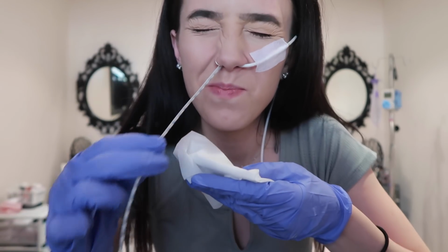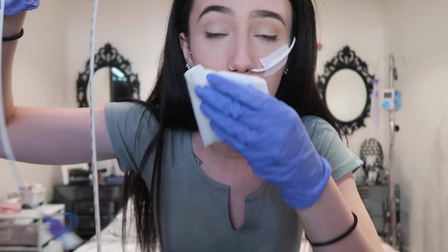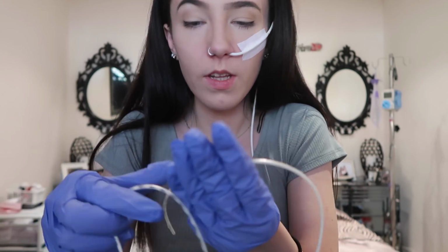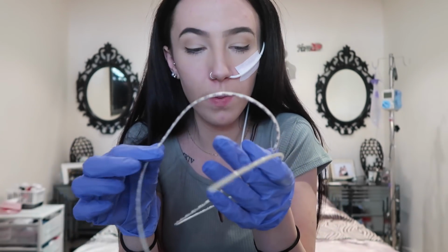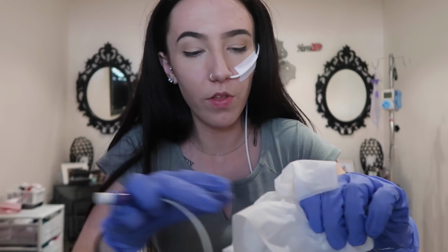Just like that, and I'm just going to wipe my nose because I felt stuff come out. So as you can see, my glove is now a bit sticky from all the gunk that is on the tube. So I'm just going to grab a couple of tissues, and I'm just going to wipe down the tube just to get all the initial stuff off it, like that.